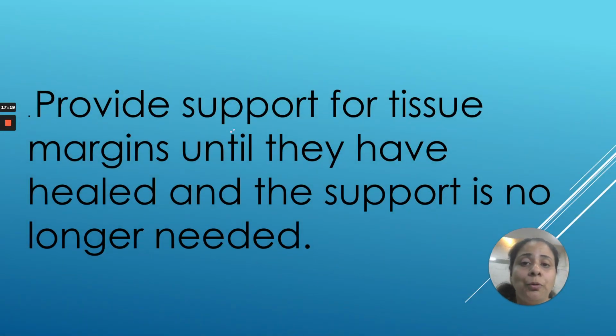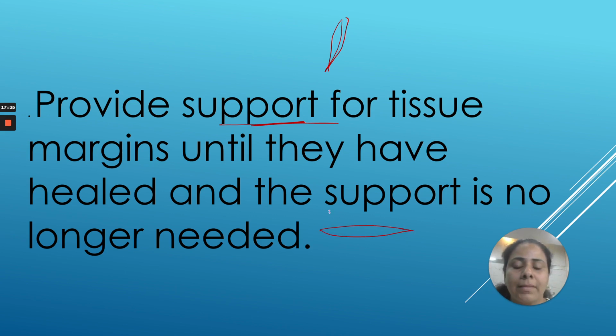Yes, to provide this support of the tissue margins until they have healed. So if I'm doing a flap surgery, so these are the flaps. Okay, so let me do it again here. These are the flaps. Okay, so these are the margins of the flap.